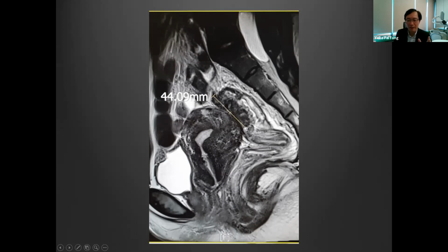You can see the lesion has one nodule here, then another nodule, a bit like a butterfly kind of nodule over here. And then these are the folds of the rectum that I told you about, the Indian headdress sign over there. But the lower rectum actually is quite nice, it's quite free. The rectovaginal septum here is very, very nice and free, right? Of course, there's adenomyosis over here. The uterus is retroflexed, right? You can see here, it's anteverted, but it's retroflexed over here. And this is a nodule that's stuck onto the back of the uterus, right? So whatever we saw on the scan, it looks very much like the MRI.